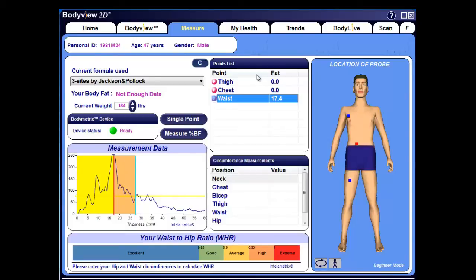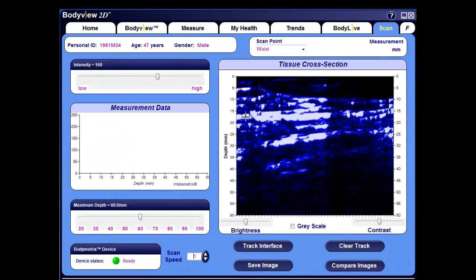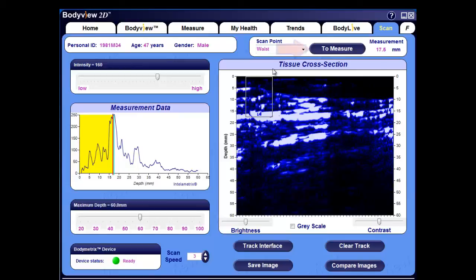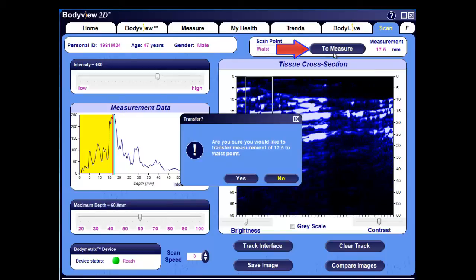Again, if we drag a rectangle from the center of the fat muscle interface to the top of the image, the total fat thickness is displayed, along with a two measure button. Clicking on this button brings up a window where you're asked if you would like to transfer the measurement to the waist point. Select yes, and if we navigate back to the measure tab, you can see that the measurement was transferred.